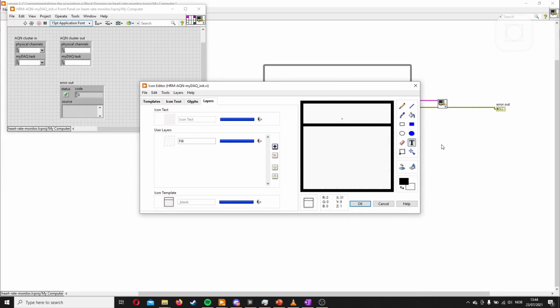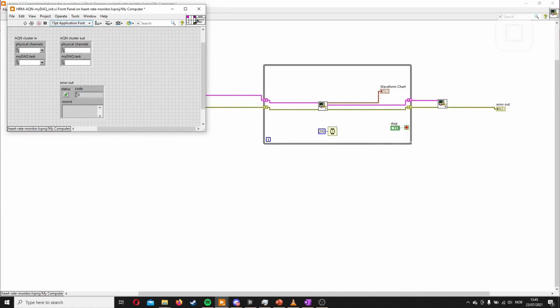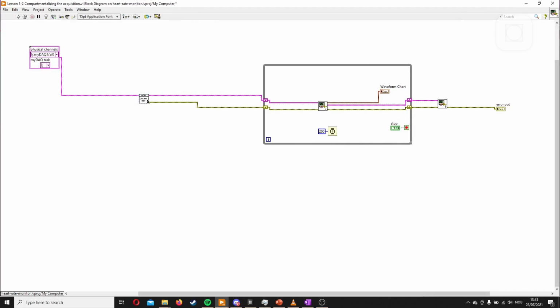And then we write here, we can write acquisition. And then here we write DAQmx init. And then okay, so you see this is there. We save it, close it, and now we have our DAQmx init. The next one is this one.